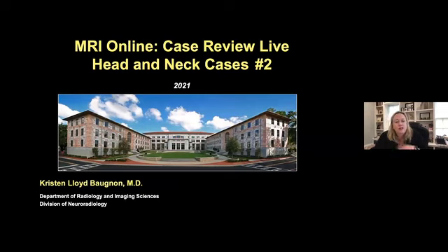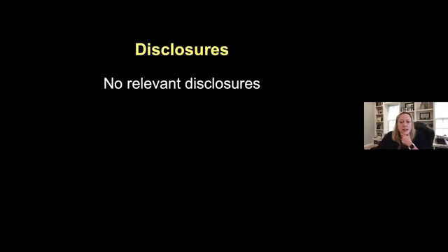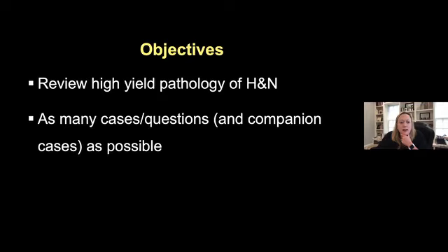As she mentioned, I'm a head and neck radiologist at Emory, and this is my second case review live session, and I'm going to hopefully go over some interesting head and neck cases today. I have nothing to disclose. My goal for today is to review as many interesting and high yield head and neck cases, questions, and companion cases as possible with you. I'm going to help you become familiar with some of the differentials and varied imaging appearance of other lesions in those locations. I have a total of 6 cases, but lots of companion cases to go through. So hopefully we'll get through all of them.